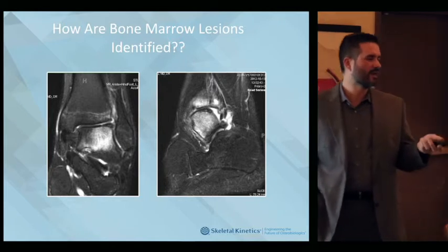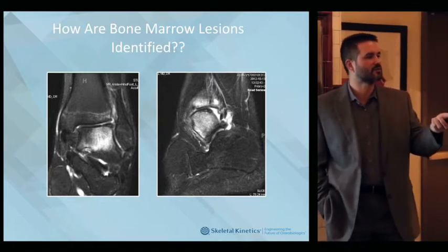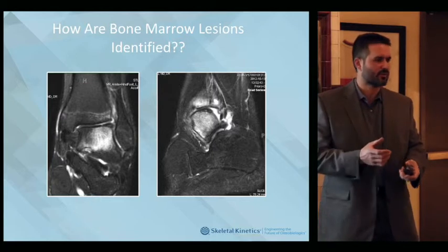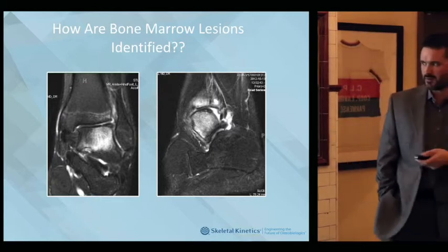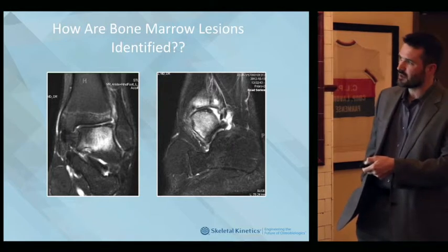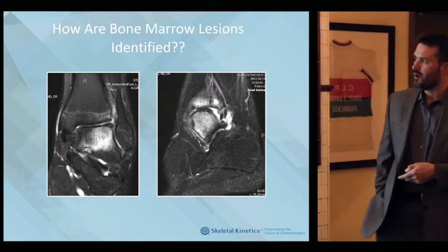Some of the radiologists may say the ATFL is sprained. You look at it, no, it's torn. You can tell when you're examining the patient. There's no way it's just a little sprain. It's definitely torn. Like I said, as a radiologist, he doesn't have the benefit of visualizing the patient. So here's a talus with significant edema, and then on this other view, you can see it up in the tibia. So that would be very painful.